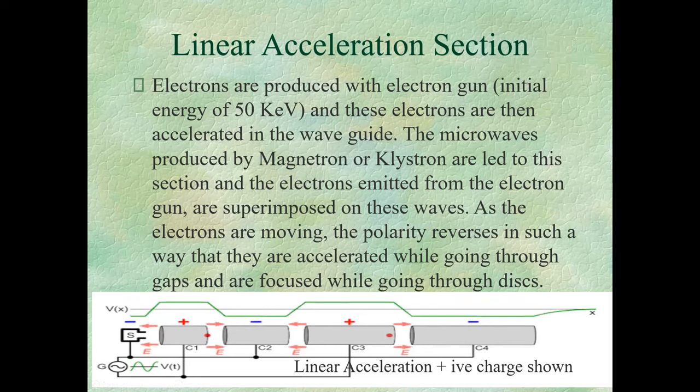So then the ion chamber. Now we are past the flattening filter and the scattering foil, and now we are at the ion chamber part of our discussion. When the beam is coming out of the accelerator, it is very important for the accelerators to monitor the beam when we are treating humans.